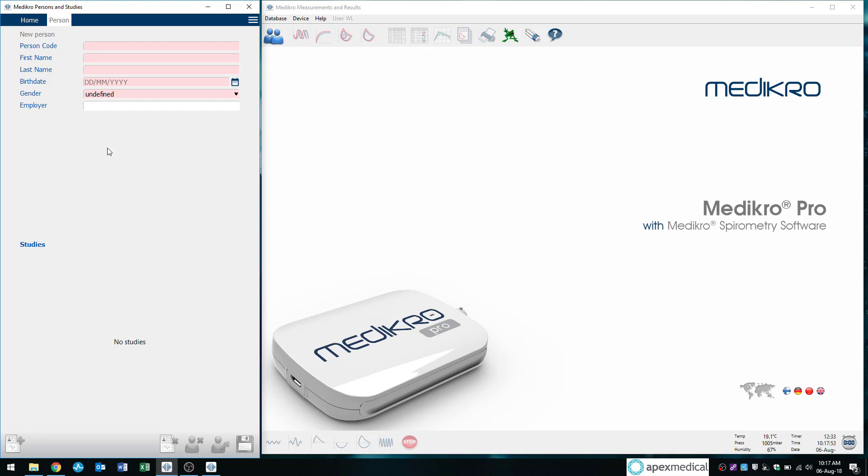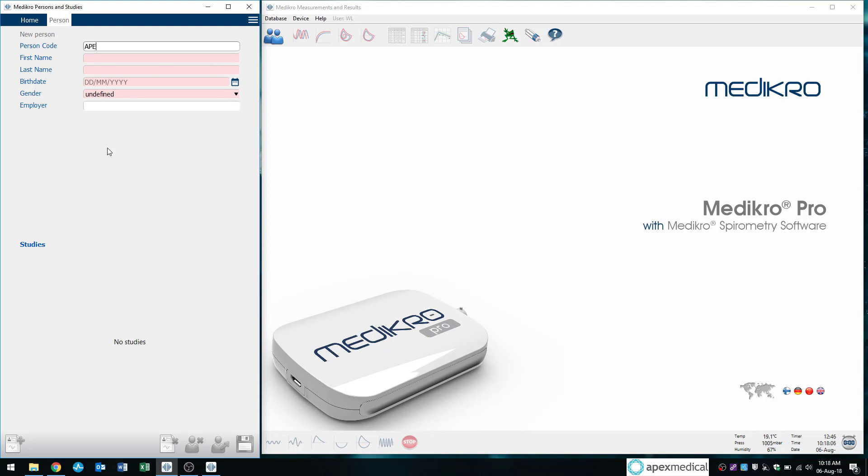So we'll fill this out. Person code, normally I recommend that my clients input an NHI or a MedTech number, for example. So I'll just put in a fake one here. And we'll be Donald Duck today.